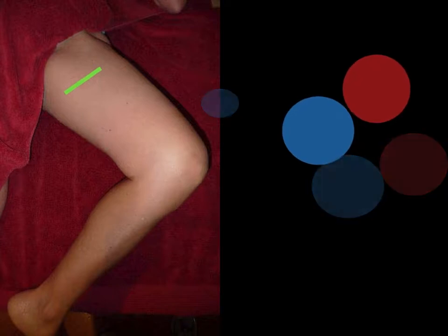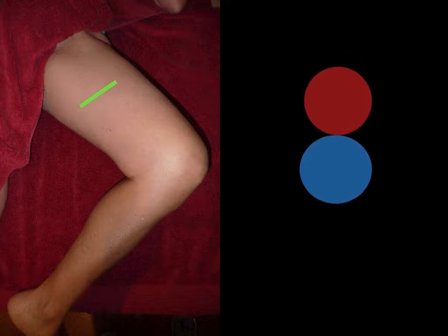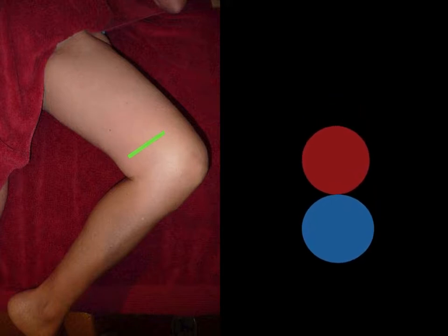As we keep coming down the leg, we're really just going to keep focusing on the superficial femoral artery and the superficial femoral vein. You should note that the vein is deep to, or in far field to, the artery. We're just going to keep coming down the leg in 1 centimeter increments, compressing, all the way until we get to the adductor canal, which is also called Hunter's canal.